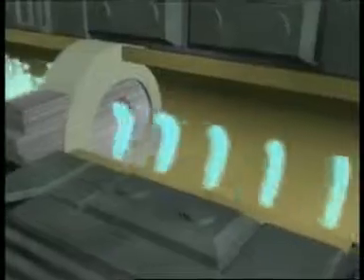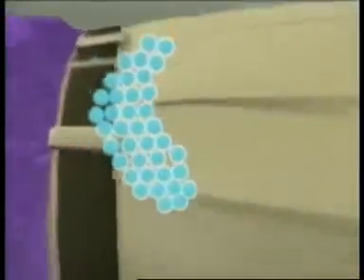The beam delivery system nozzle is the last device the proton passes through before entering the patient's body. The nozzle shapes and spreads the proton beam into three dimensions, conforming it to the target tumor.